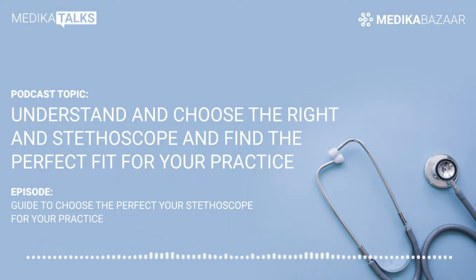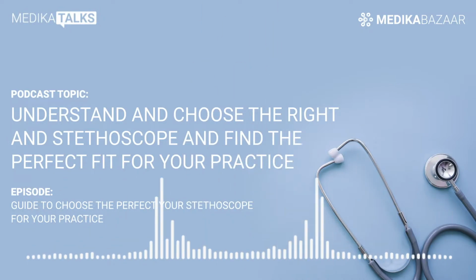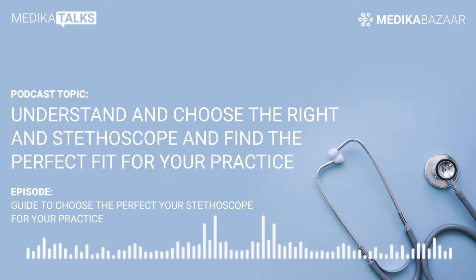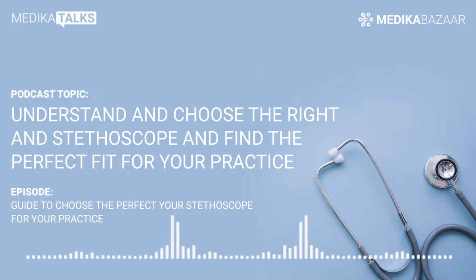Doppler stethoscope. Doppler stethoscopes are used to measure the Doppler effect of ultrasound waves reflected from various parts of the body, like the beating of the heart. It detects motion by detecting changes in frequencies. Doppler stethoscopes can be used in dealing with moving objects.